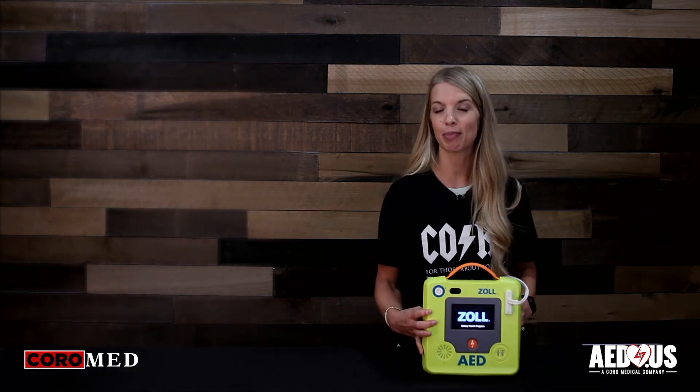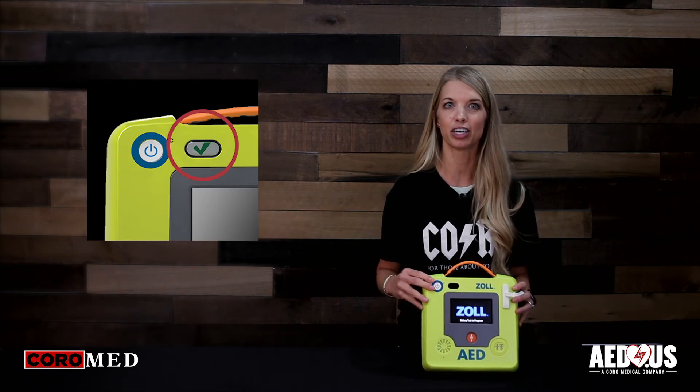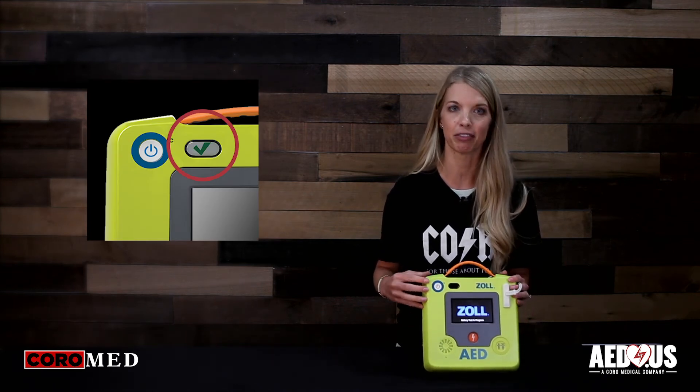Once you've changed the pads or battery, verify the status indicator has a green check mark and the AED is ready for rescue.